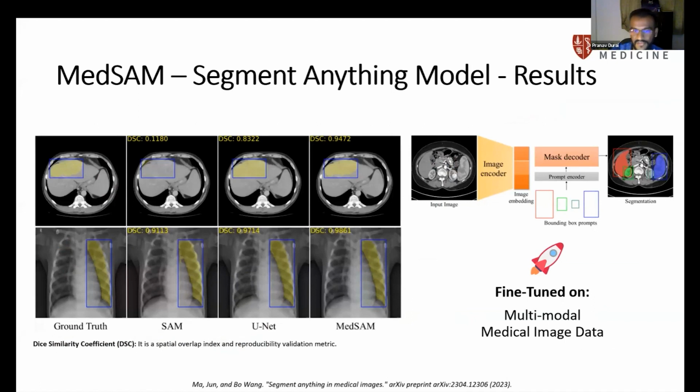Fine tuning is the process of making a specific AI model more specific for your particular use case, right? So in this case, you're trying to perform inference on medical images. So you fine tune the already pre-trained model with custom data from your experiments, right?